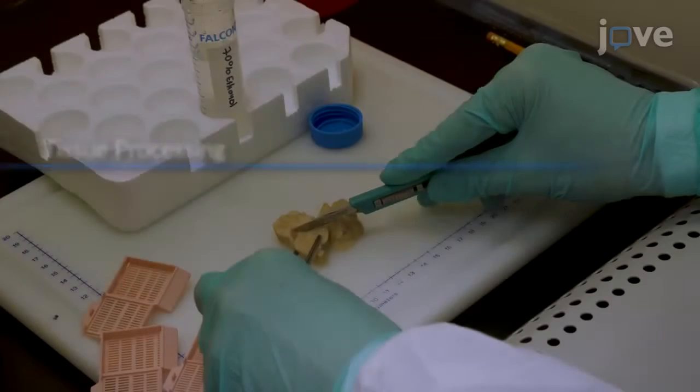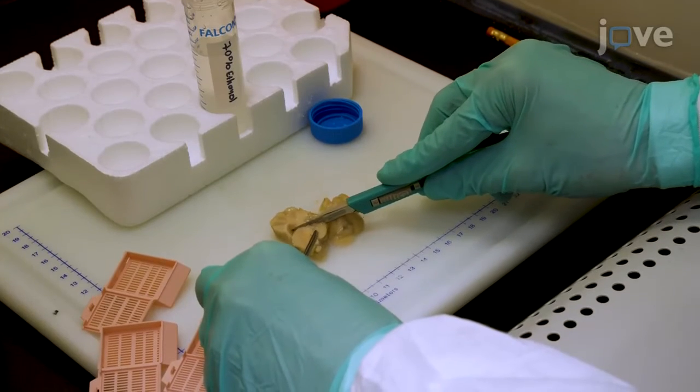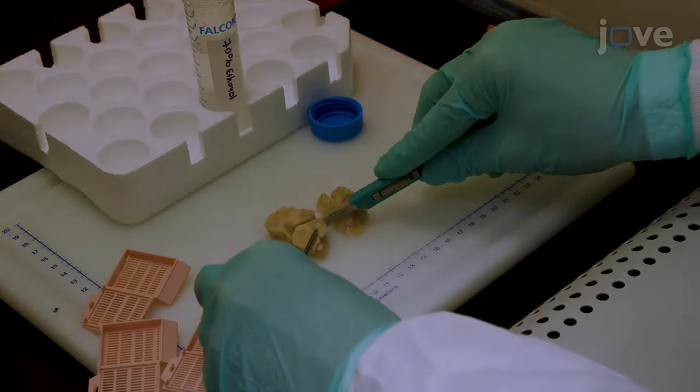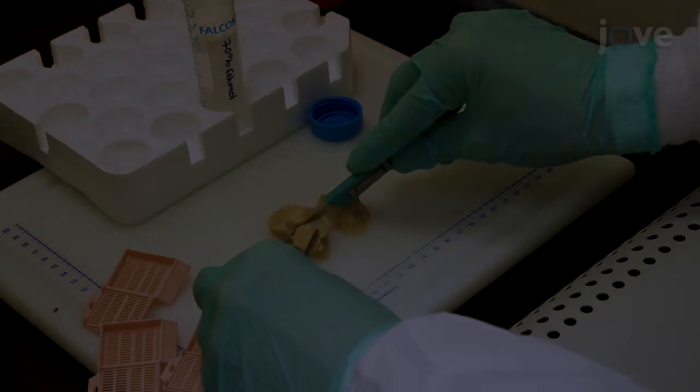Following the specimen fixation, dissect the tissue to include the important brain areas.